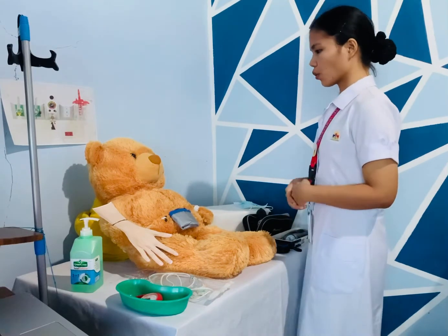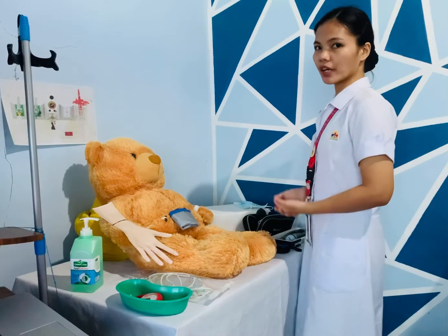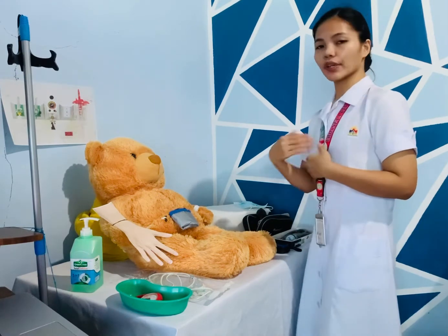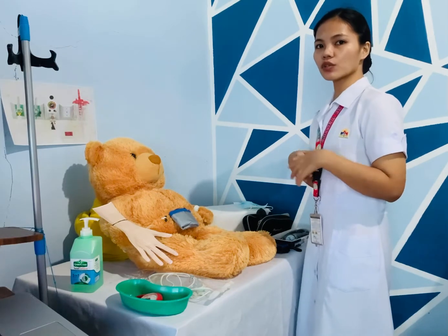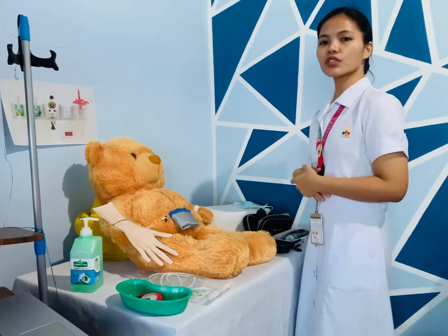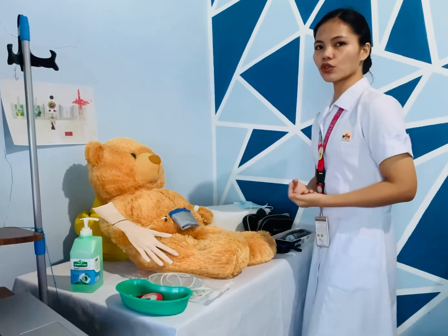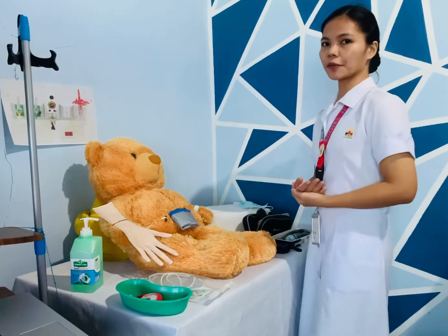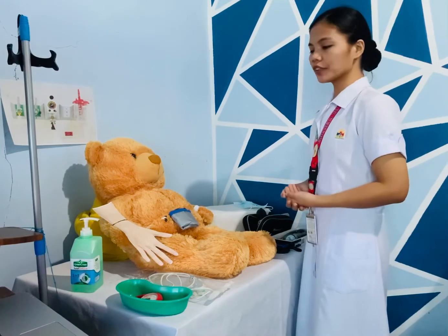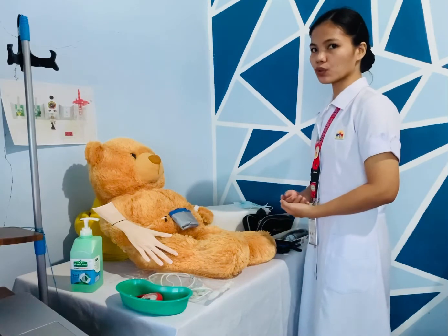Okay. So, the first thing that I'm going to do is the preparation. So, I'm going to turn on the light here in the room and then close the door or the windows to provide privacy. And I will also make sure na naka-off yung electric fan or the air conditioner. And then after that, I will now prepare the equipment that I'm going to use.